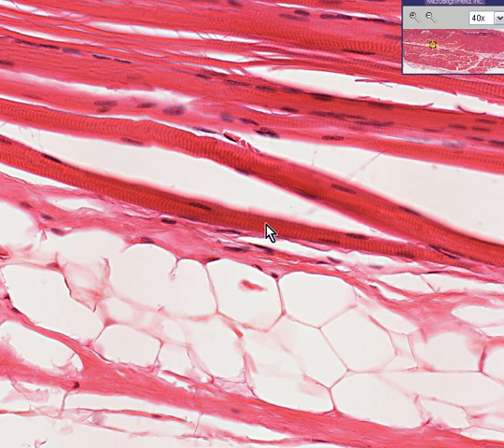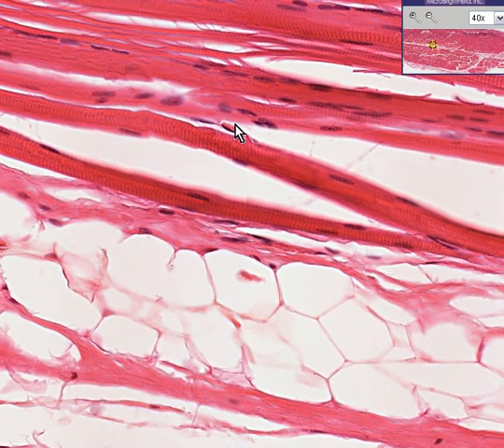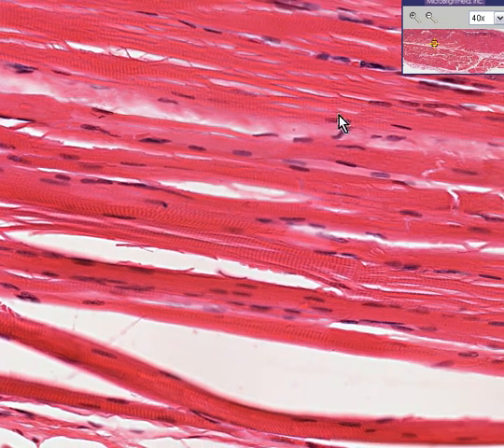These fibers are a lot thinner than normal, if you remember from the previous normal set. In addition, there is some fat between the fibers. This is once again a denervation type of atrophy. Why might it be like this?